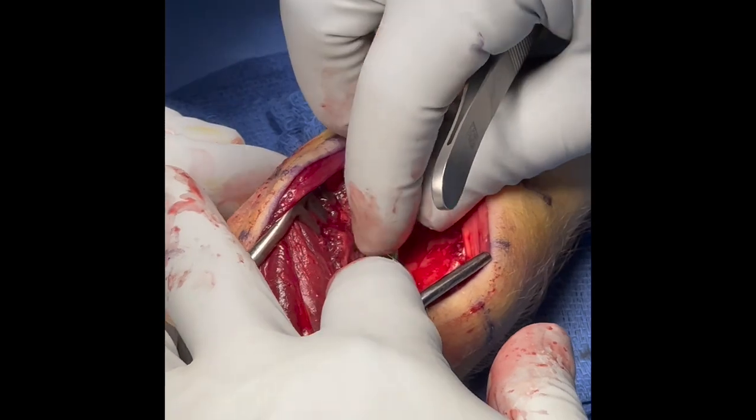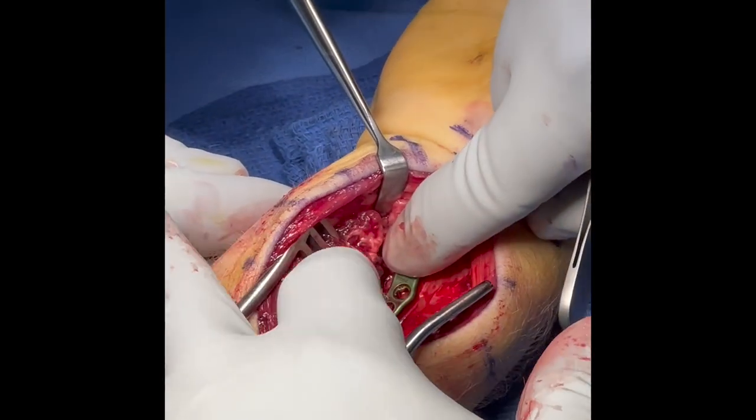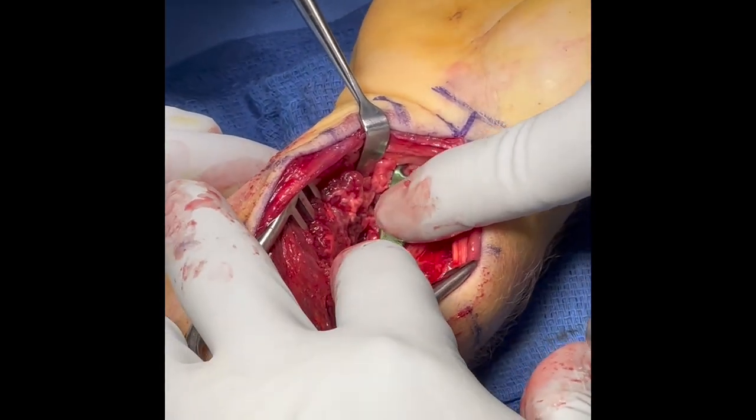The hook plate is placed initially, and the plate is adjusted so the hooks stabilize this very distal lunate fragment.